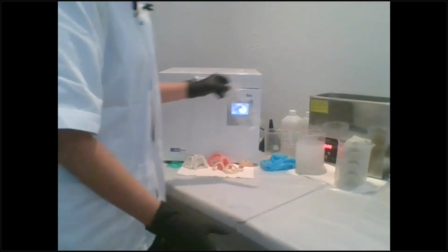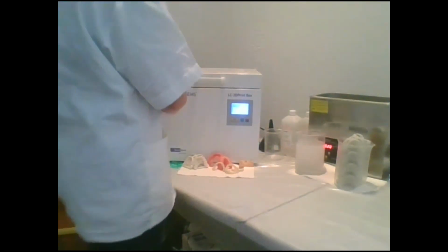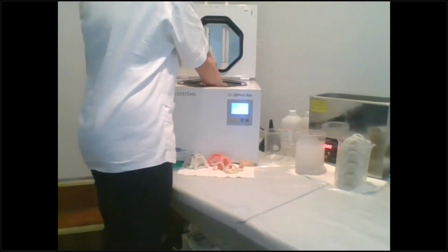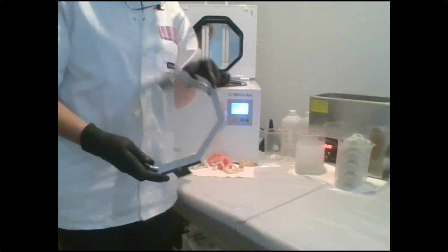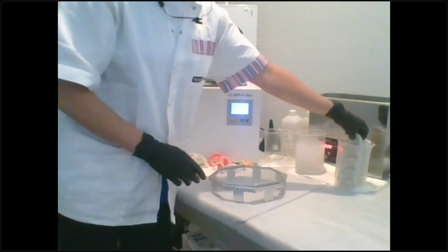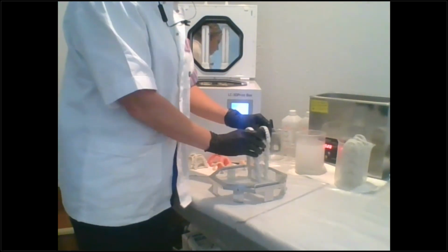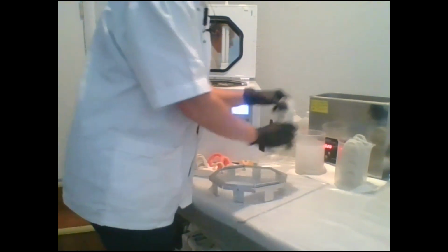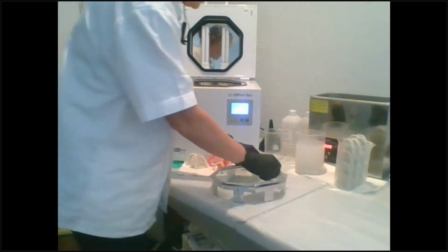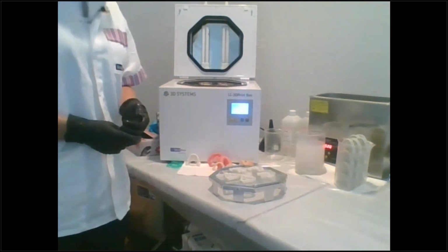Okay, it's a really big build area or a cure oven area. In fact, I'll show you the platform in here. So you can see how large this platform is, and you can fit multiple builds on your platform. You just want to make sure that they're spread out slightly, so this way the light can get in between all of them. Now, if you're doing single larges, a single row, and you only have 6, just place them normal on the build platform laying out.